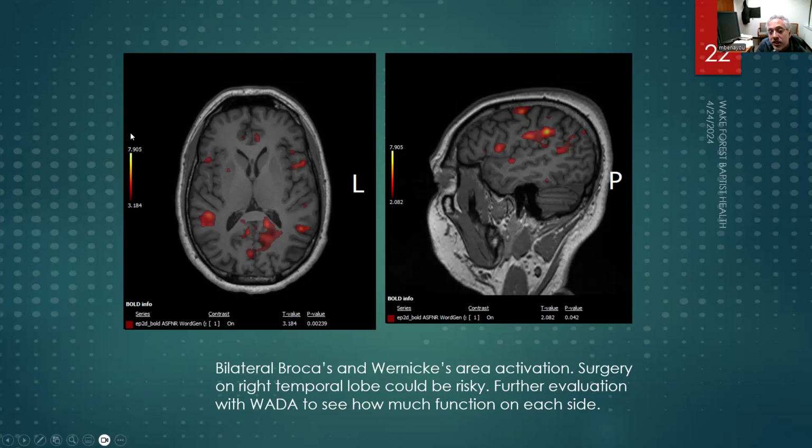And so all we do is essentially color code the p-value for a statistic that asks the question, how confident are we that beta is not equal to 0? You know, how confident are we in rejecting the null hypothesis that the beta coefficient is 0? And the stronger it is, the more yellow. And if it's on the border, it's more red.